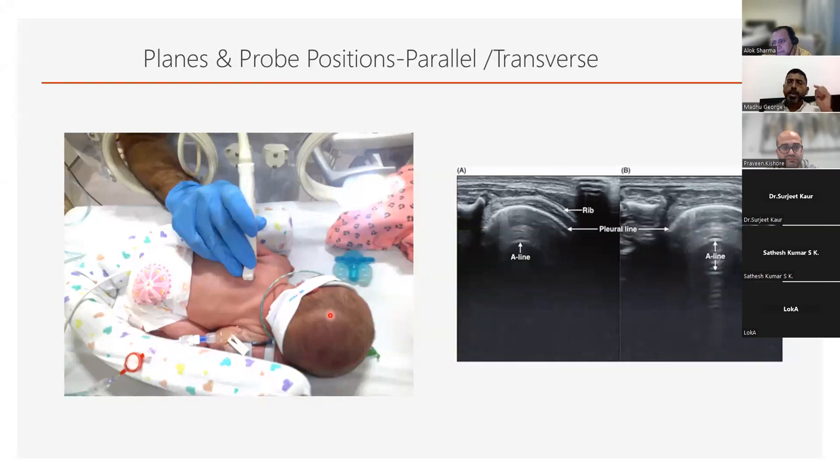And where is the probe marker on the right side of the image? So this is not the image that corresponds to this probe. So you can't see it. Yeah, my apologies. But when I show you some scans next time, I'll be able to explain it to you. The important thing from your perspective is it just means you know where pathology is in relation to your probe marker. And it's always towards the right.